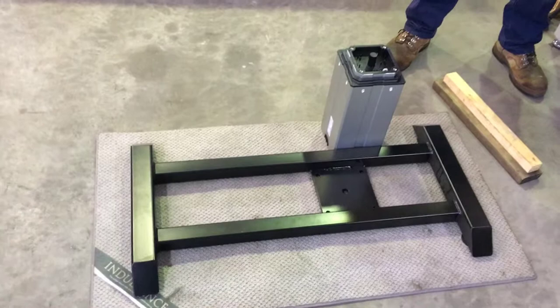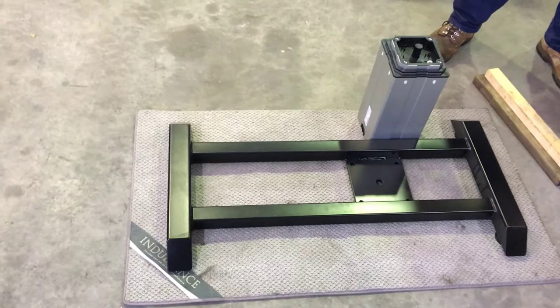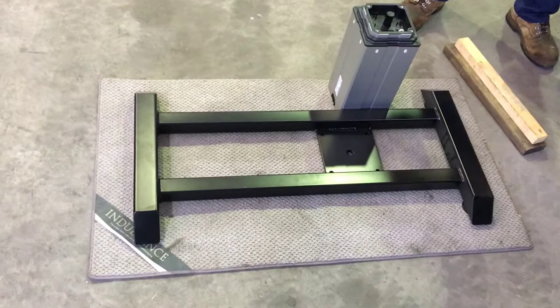Here we're going to show you how to replace an actuator. What you've got is your base with your head and the pillar taken off. We're just going to go through the steps to actually add the component in.